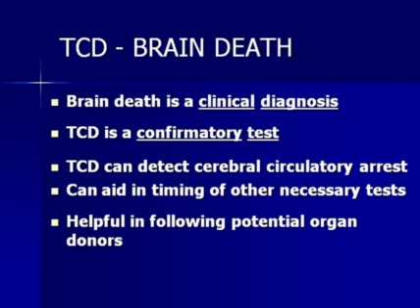Another purpose for transcranial Doppler is basically used to confirm brain death. Brain death, of course, is a clinical diagnosis. It's not going to be made by transcranial, but transcranial will be used to detect what the cerebral circulation is looking like, and obviously can help aid timing of additional tests, and also potentially help prepare a patient who might be a potential organ donor.